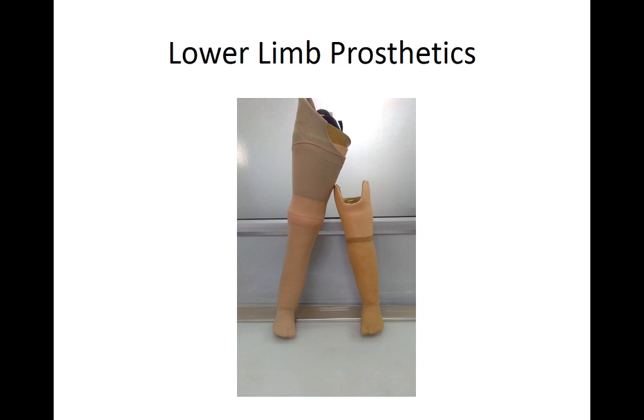In my experience, a patient after fitting the limb, say after 2 or 3 months, calls up and says, my limb is getting loose. What is wrong? The main thing is that there's a volume reduction in the entire circumference of the anatomical limb. In that case, there'll be a need to change the socket again.